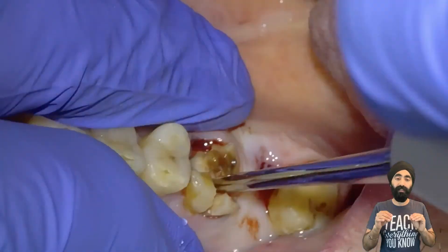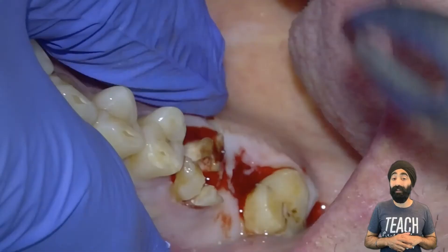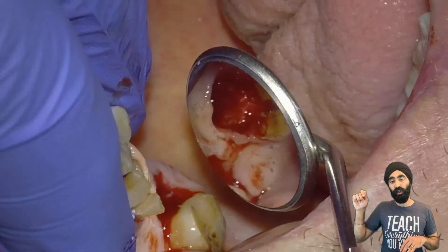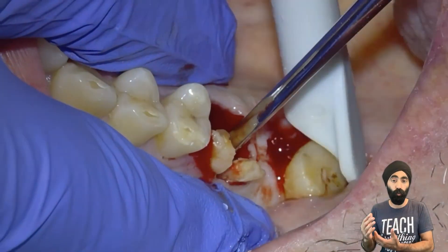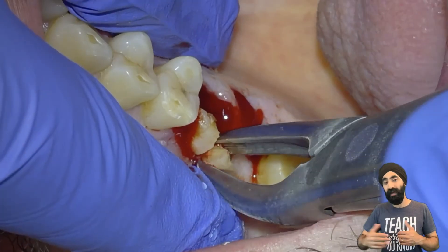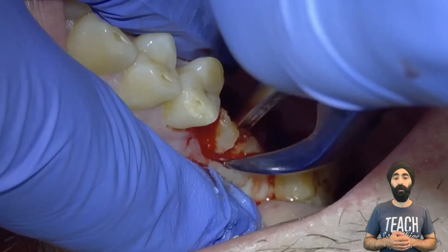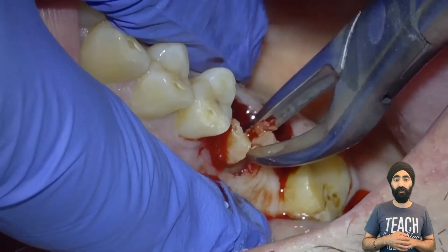The root you remove first is whichever one wants to come out first. You can see straight away it's the palatal root that's becoming mobile first, so I go ahead and remove that — a bit of rotation and it comes out nicely. It also confirms that my section was a good one. In my early days of extractions, my sectioning was hit or miss, but from practice my sectioning got better. Now I'm going to remove the disto-buccal, doing some rotation movements with my root forceps, and that comes out very, very nicely.